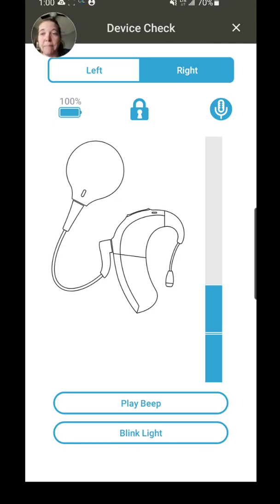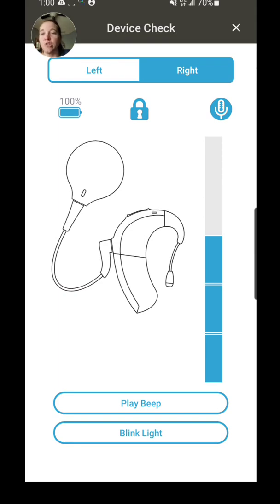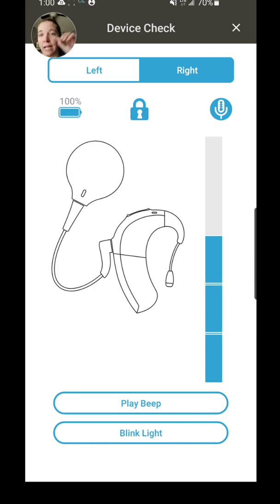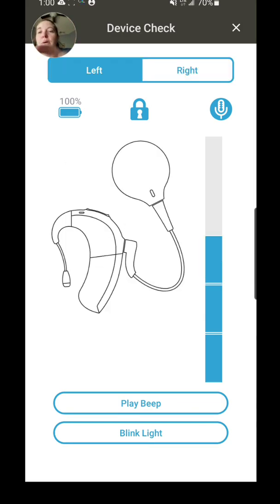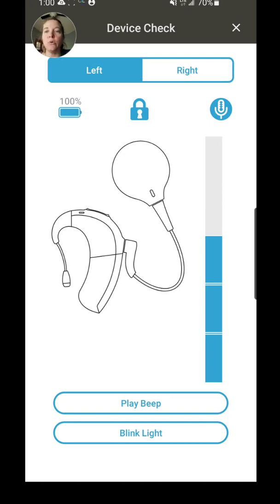Quick tip: if you ever lose your processor in a room and you can't find it, turn out all the lights, launch your app, and then click Blink Light. It'll flash that light—might make it easier to find in the dark. So anyways, those are the options for checking the device.